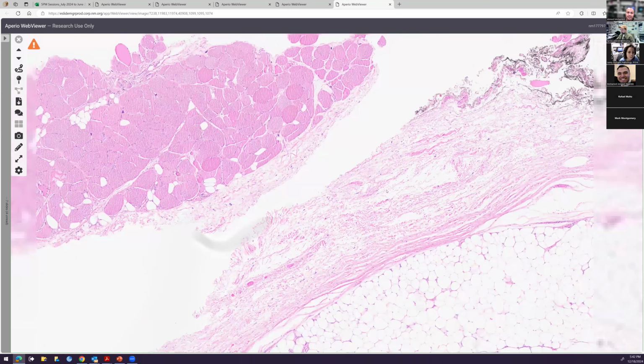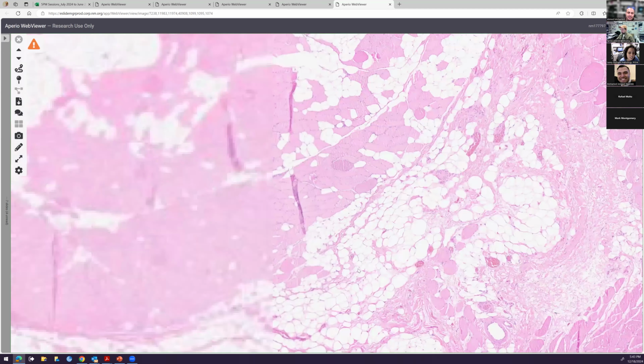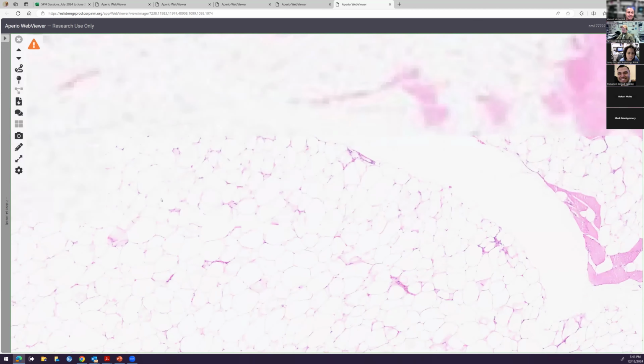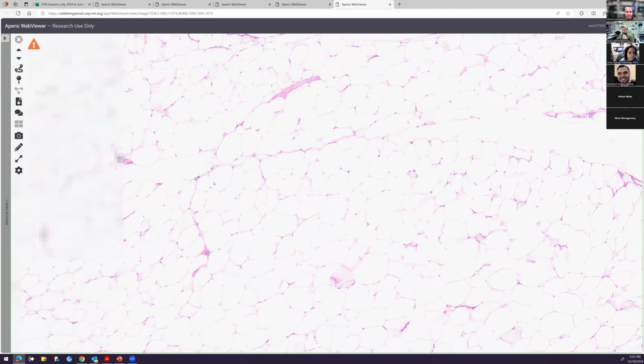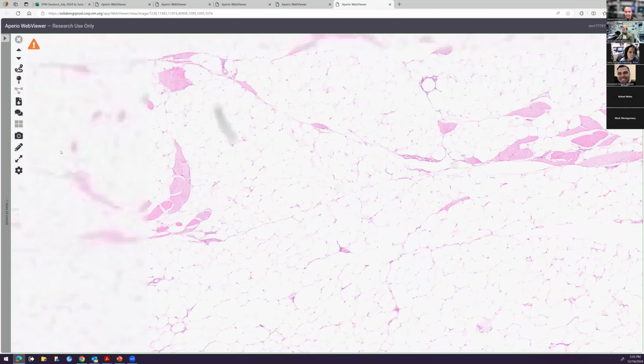Right, exactly. So as you start to go through here, you might spot it. But you can also see that it's pretty few and far between, right? Like I mentioned before, you don't need that many. You only need one technically, one hyperchromatic cell. So sometimes they just look like lipomas pretty much.